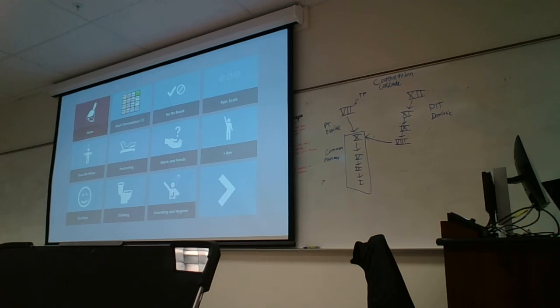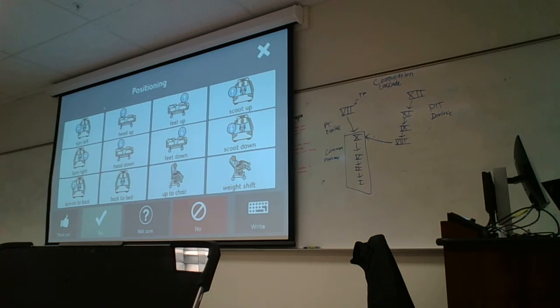This here is Communicator 5. This is a page set that I use often when I go out into the field in hospital settings, with some of our ALS patients, where some of our adult users need some pictures for context, and you can always take these out as well. But they're able to communicate their wants and needs in different types of settings. So there's things like "Please turn me to the right." That deeper voice is a more adult voice. That's Ryan. These page sets do have the yes, no, not sure on the bottom, so that they can quickly communicate with their caregivers, with their doctors, any messages that they may have.